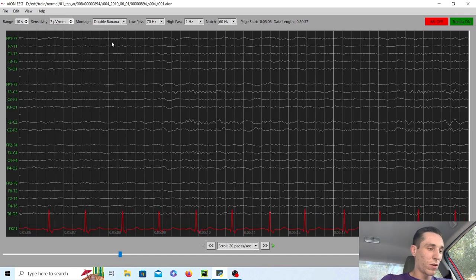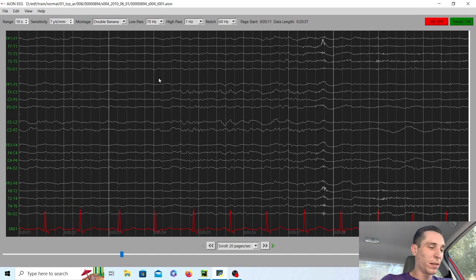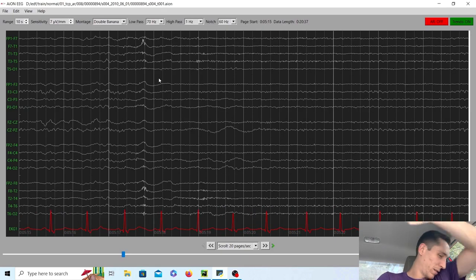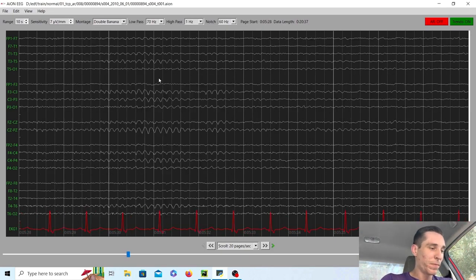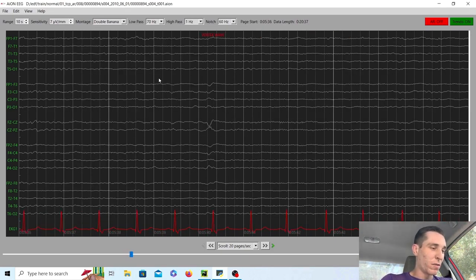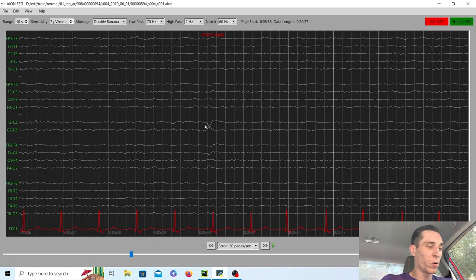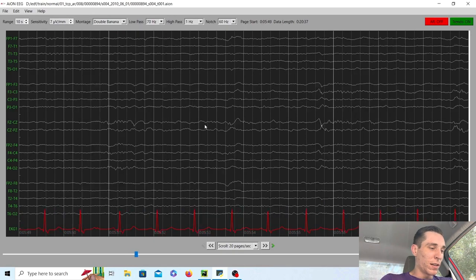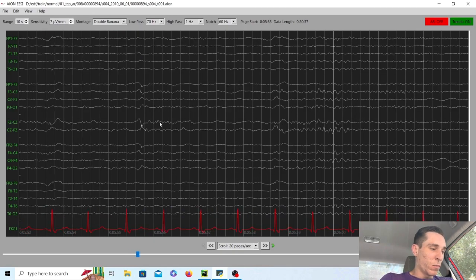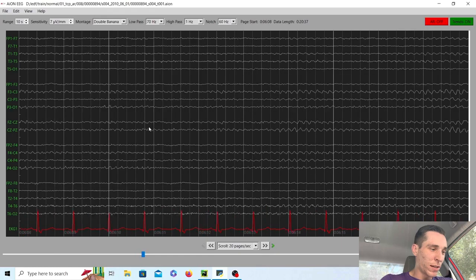So they're probably starting to get sleepy here. And the background is kind of like waxing and waning. It's kind of going away and you're starting to see these vertex waves appear more often. More vertex waves as we scroll on.